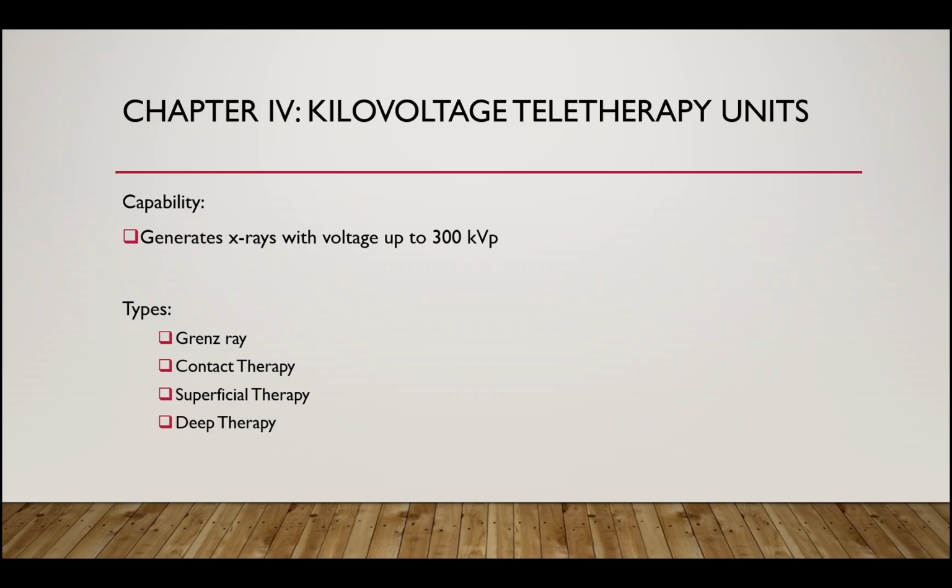Okay, so there are still some who use lower energy beams, especially when the treatment is for superficial skin lesions, where they still use kilovoltage teletherapy units. So first, let us discuss Grenz ray.